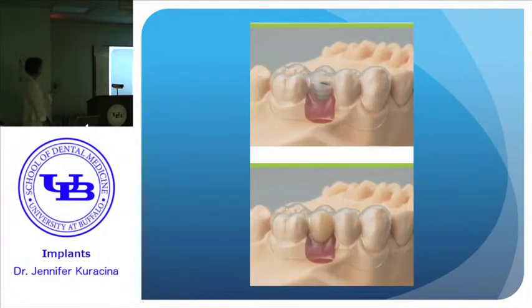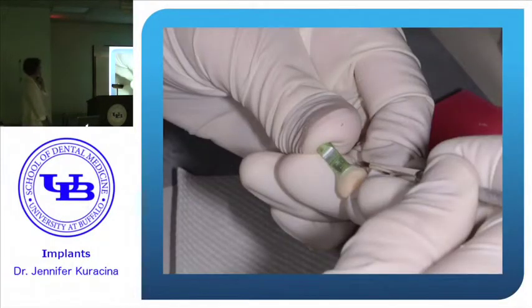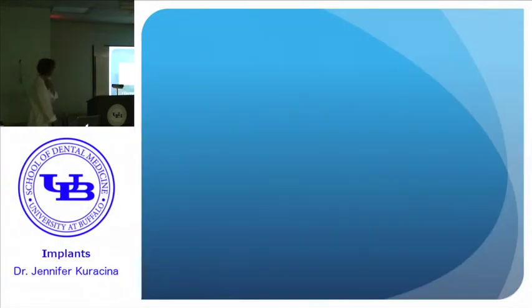There's a temporary coping that you can use. Personally, I never do. You don't really need it, but it's there if you want it. But it gives them the opportunity to make the nicest margins ever, because they can just seat the thing on their abutment replica and tune them up, polish it up nicely.